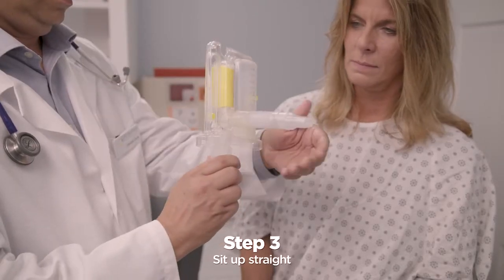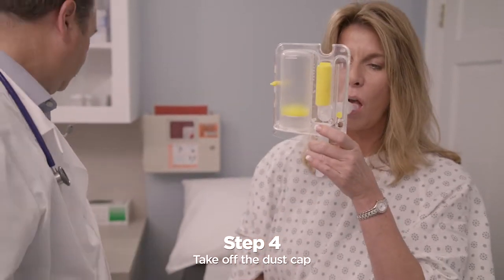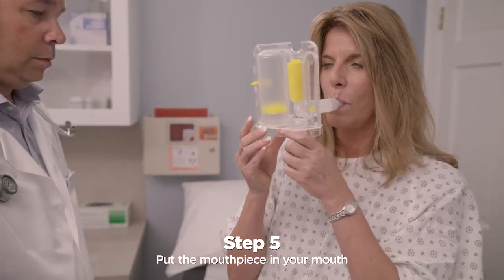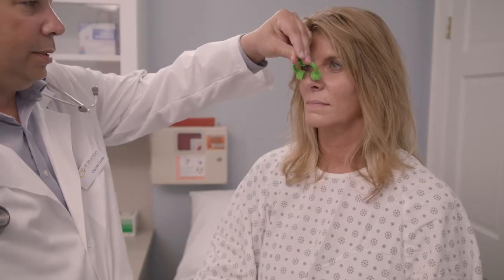Sit up straight so that you are comfortable. Take the dust cap off the IPEP mouthpiece tube. Put the mouthpiece in your mouth and close your lips around it to make a good seal. Your healthcare practitioner may tell you to use a nose clip if needed.